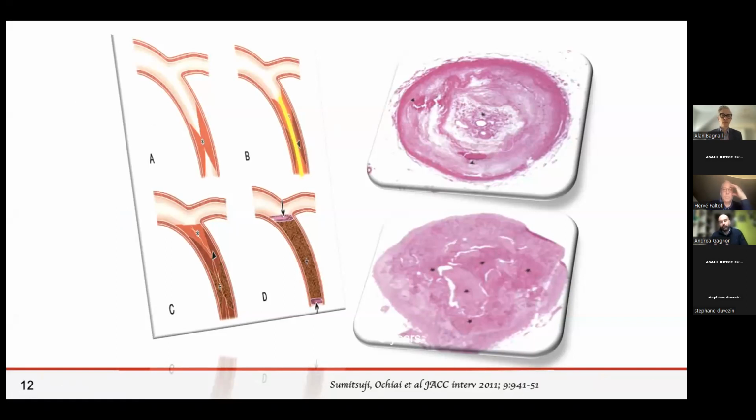With some microchannels and soft tissue, you can use something which is not so penetrative. That is different from what you need in the last case, where you have a lot of calcium, tough structure, and bifurcation representation, and you have to be a little bit more aggressive in order to cross.